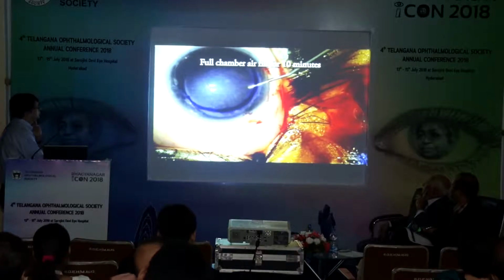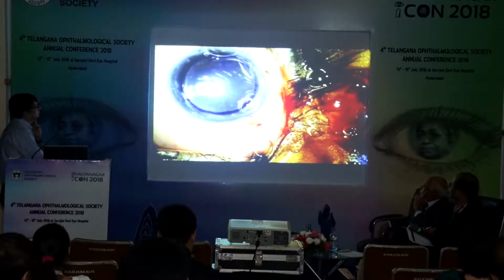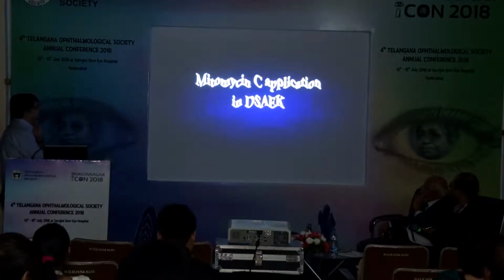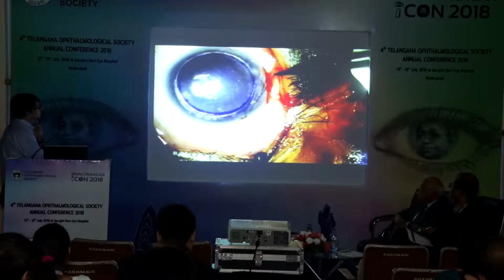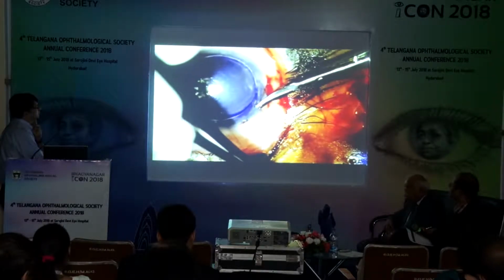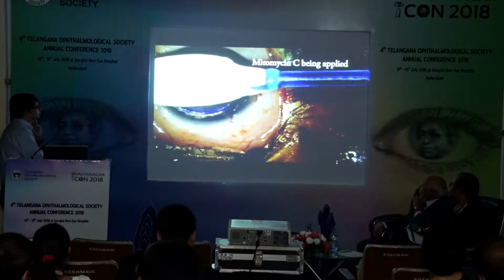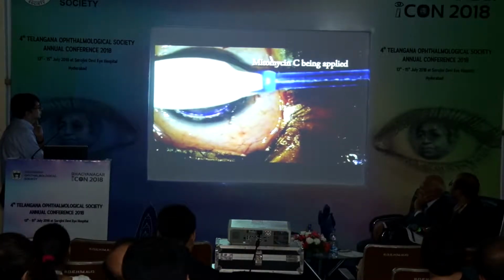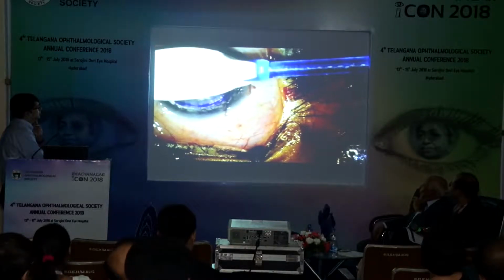Following graft insertion, full chamber airfill was maintained for 10 minutes. After sealing all the ports, the anterior chamber was filled with a full chamber air bubble. These robust steps would ensure that mitomycin C would not seep into the anterior chamber.